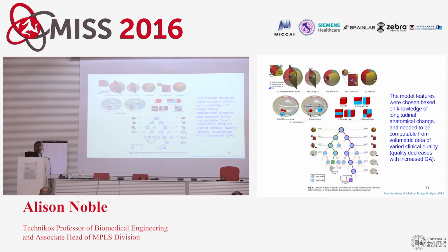She also used context features, particularly using knowledge from the literature as to where in the brain there might be structures developing at a given point in time. That allowed her to design a set of features and feature positions that could be used to look for the sonographic patterns important for age discrimination. And then, having thought carefully about the features to use, she could build the regression forest to develop the solution.